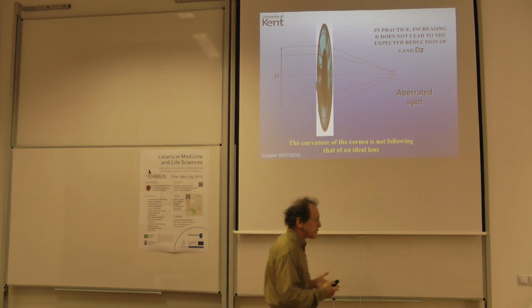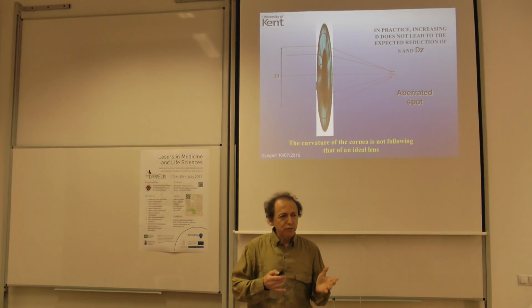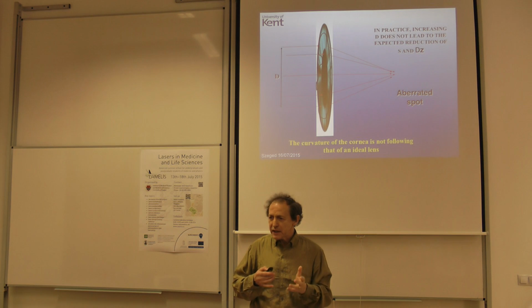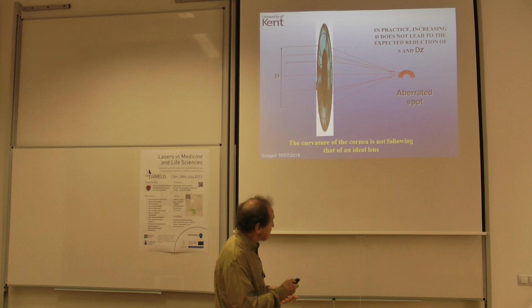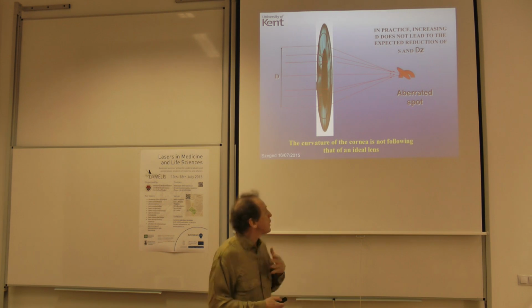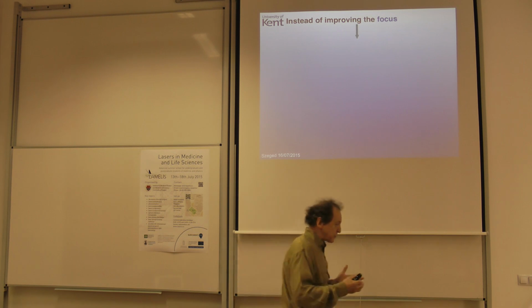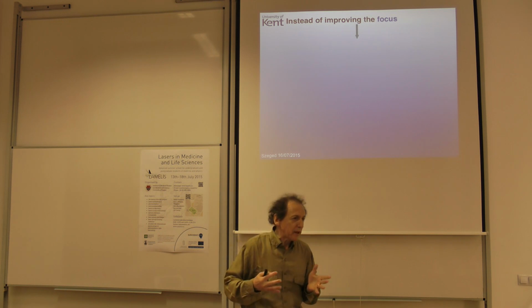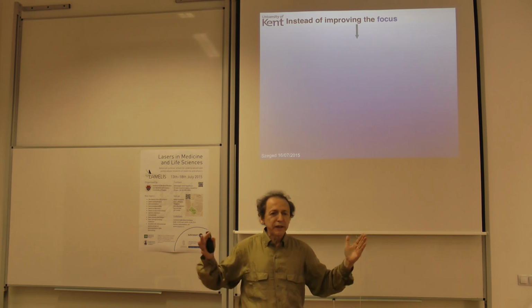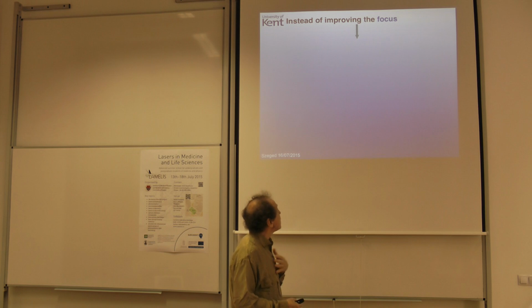We cannot take advantage of the geometrical optics by, let's say, fine, we can beat diffraction by increasing the beam diameter and creating a better spot on the retina. That's not possible. So, if that is not possible, you see, there are all sorts of aberrations. There is a theory of aberrations, there is astigmatism, coma, and so on. So instead of fighting with the focus, so we cannot focus because the retina is too far away. It's too far away to focus any better. If it's so far, we need to dilate the eye even more. But even if we dilate it, we encounter the problems from the aberrations in the anterior chamber.